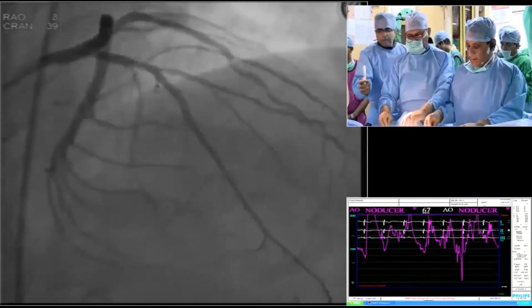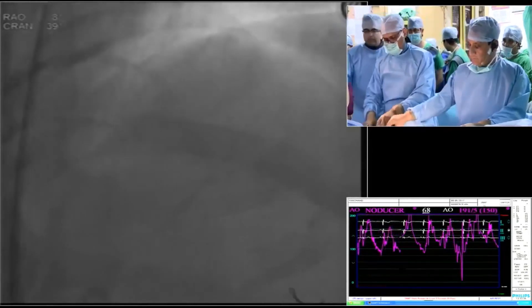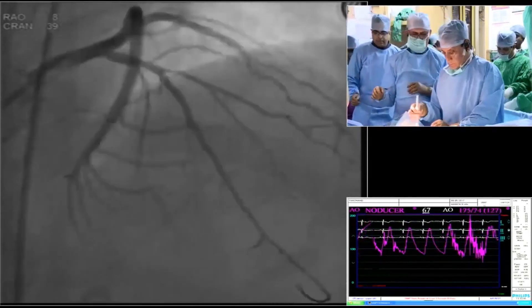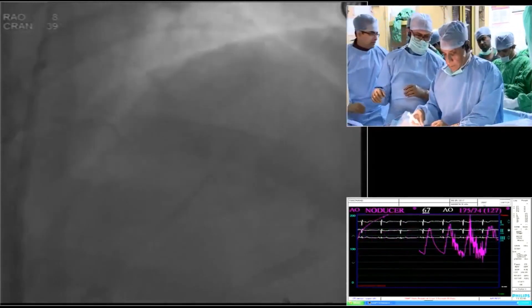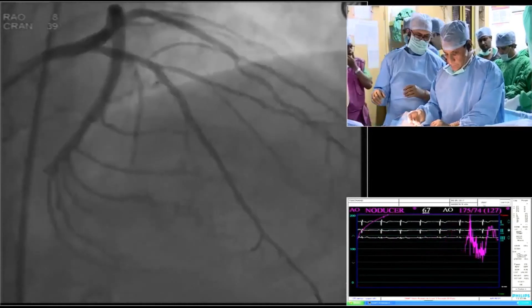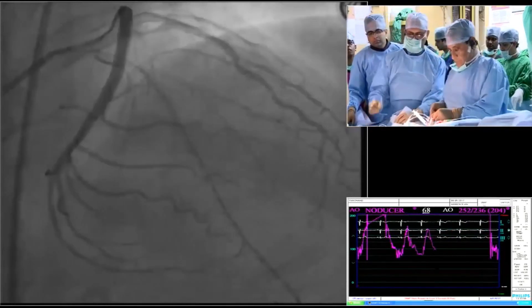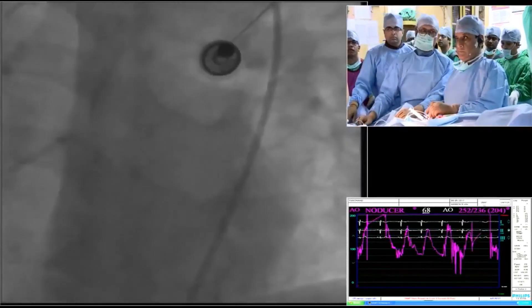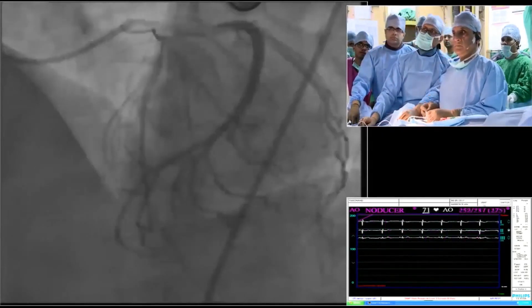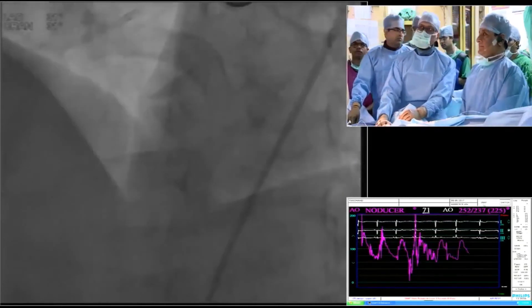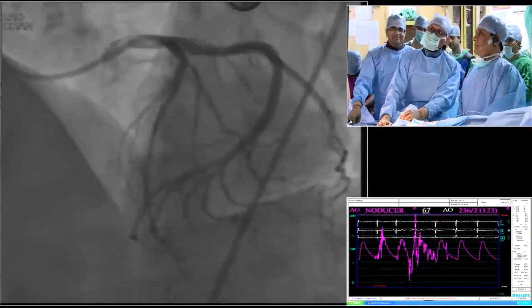Let's give a nitro and take a last picture now. Go to LAO cranial. Thank you. Very good. If there's no question, we are done from here. Perfect. Congratulations — perfect result.